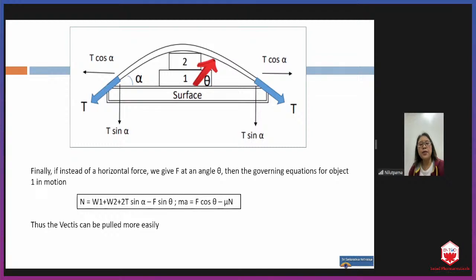And in order to slide out the nucleus easily, we'll have to inject visco over the nuclear fragments continuously before delivering it, so that the friction between the endothelium of the cornea and the nuclear fragment is less, thereby creating less frictional force between both the nuclear fragment as well as the endothelium.